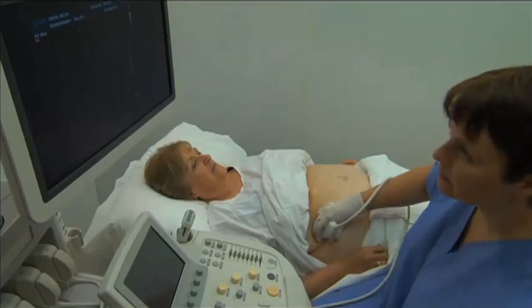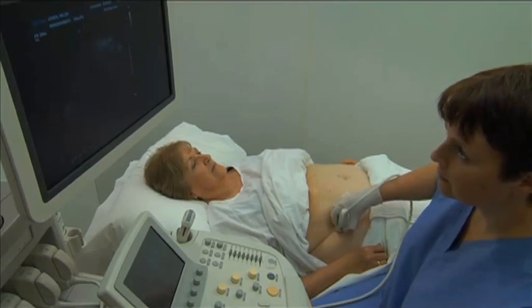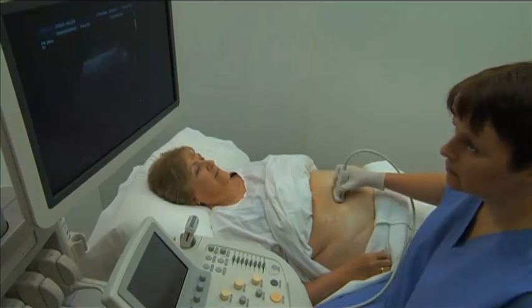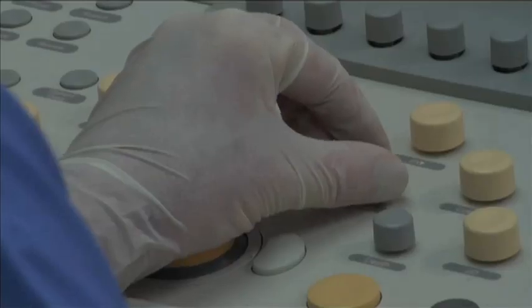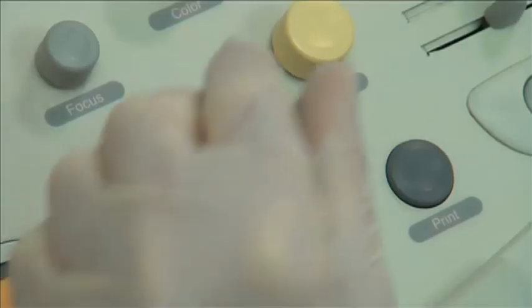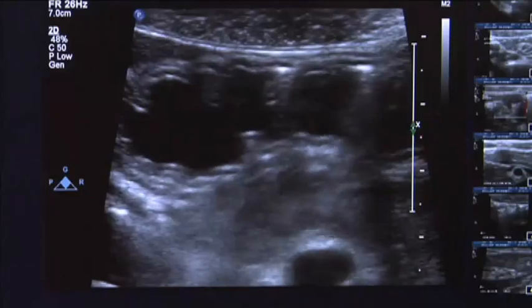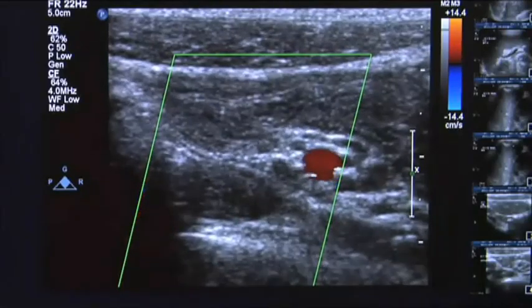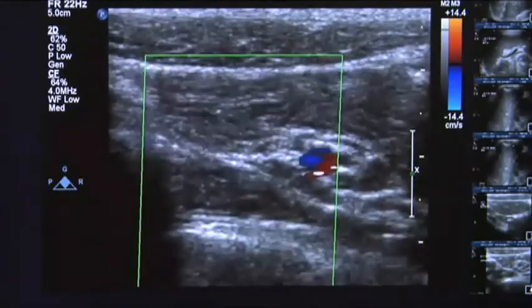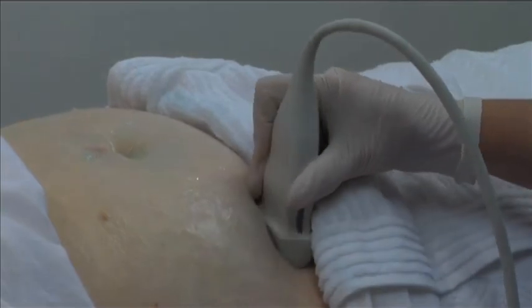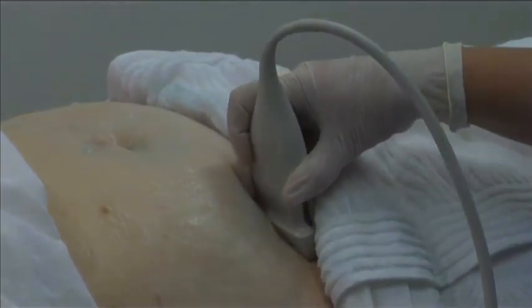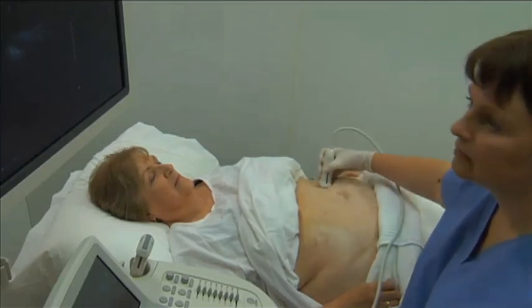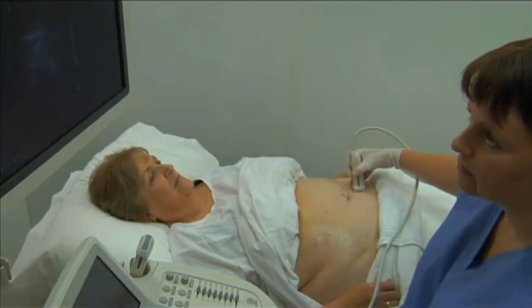Scanning of the gastrointestinal tract is usually performed as part of a full abdominal ultrasound study. Images are retained only if pathology is observed during the scan. When scanning the gastrointestinal tract, remember to ensure proper focal zone and depth placement. Evaluate and document gastrointestinal structures in two imaging planes, and evaluate and document vascularity of abnormal structures using color and spectral Doppler. Obtain images in both the longitudinal and transverse planes. The decision as to what parts of the gastrointestinal tract to image will be guided by the findings of the survey scan and by the patient's presenting symptoms.